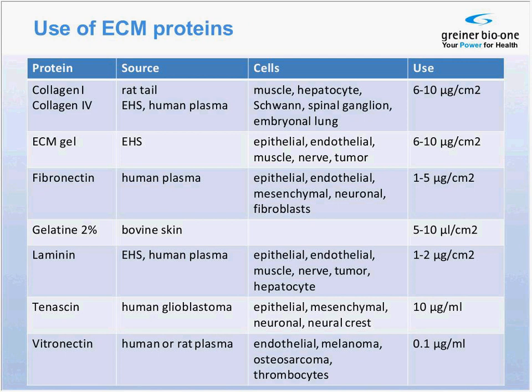Depending on the need, or where the original cells originate from, several extracellular matrix proteins that are available from commercial suppliers can be used to coat the polystyrene vessel in order to facilitate cell adhesion to the polystyrene surface. Very common are collagen proteins, fibronectin or laminin. ECM gels such as Matrigel can be used especially for the culture of stem cells.